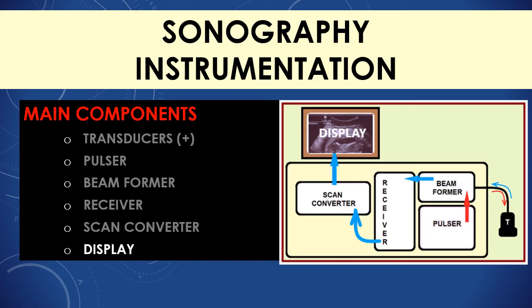Hello everybody, this is the last lecture for the instrumentation of ultrasound sonography. And this is about the display. As you see here, this is the display, the monitor. And this is visual display, of course, it's not audio. The audio display is through speakers, and this is something we can use with Doppler. But this here is the visual display.